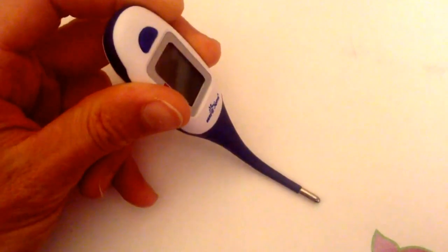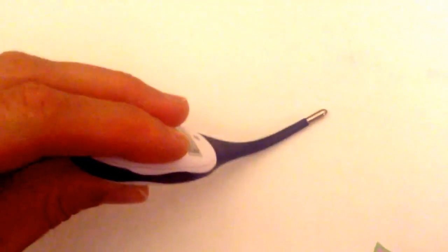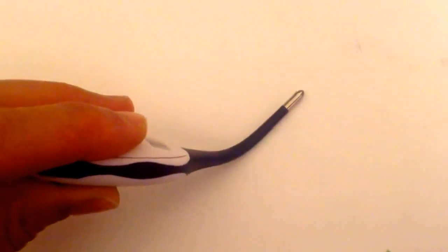The first time I got my hands on the Easy At Home Digital Thermometer, I quickly noticed the flexible tip which makes measuring, especially with children, much more comfortable. The tip bends softly and adjusts to the contours of the body.